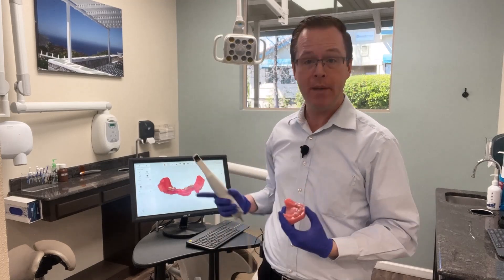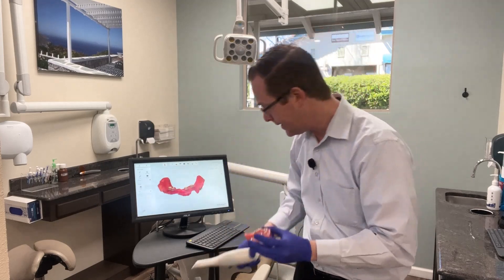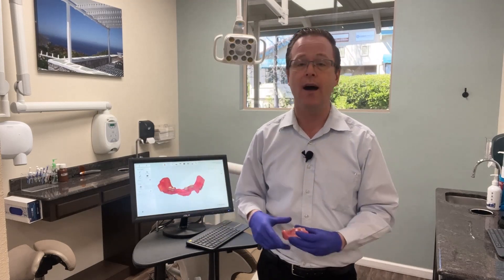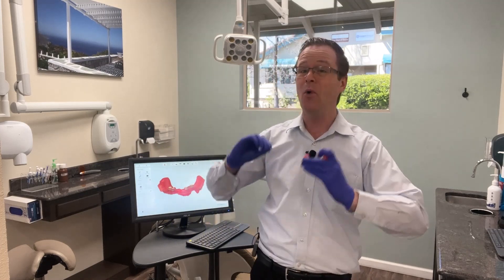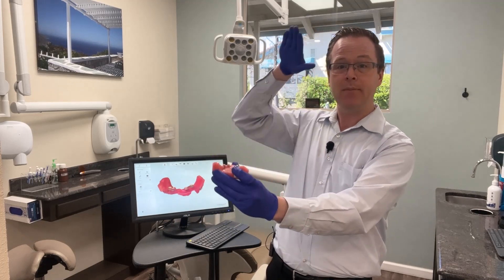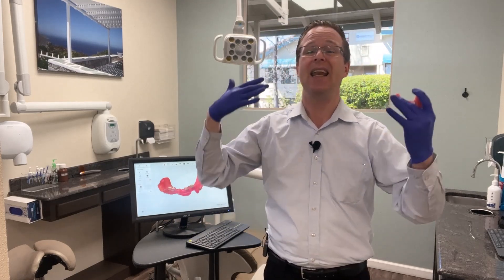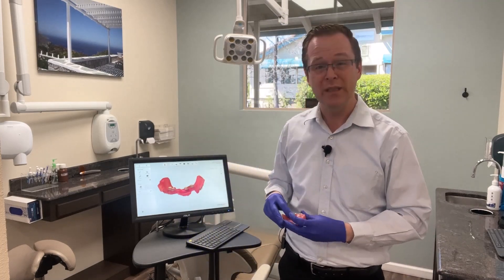Some intraoral scanners allow you to use a slider to change your optical length on the fly — more power to you. What helps me is I simply back my hand away, go back in, back my hand away, go back in, and I bounce. The locator bounce makes this procedure really pretty straightforward.